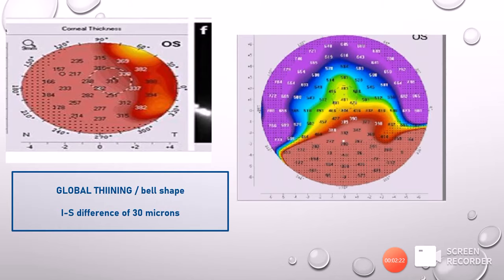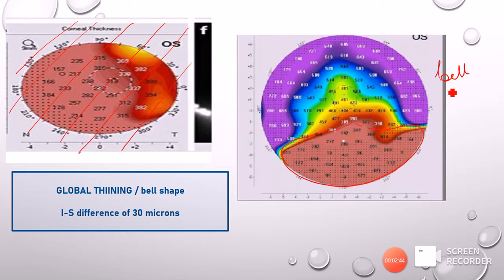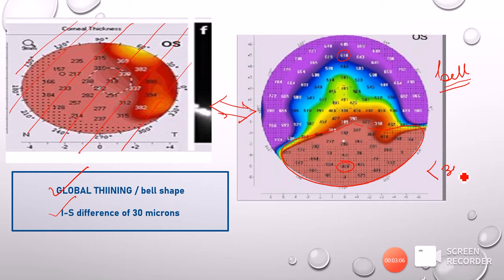Based on the thickness map profile shapes, you can also identify diseases. A globally reddish thickness map indicates global thinness, seen in keratoglobus. An inferior thinning in a bell-shaped map is seen in pellucid marginal degeneration. These shapes on the tomogram are definitely risky. Additionally, the difference between the inferior and superior thickness measured symmetrically should be less than 30 microns. More than 30 microns is risky.